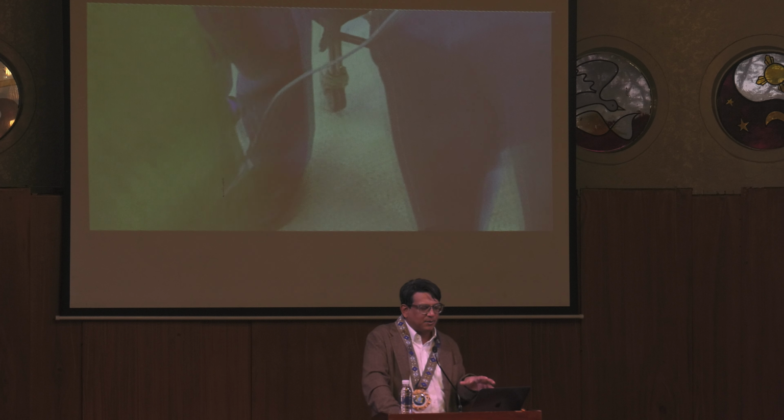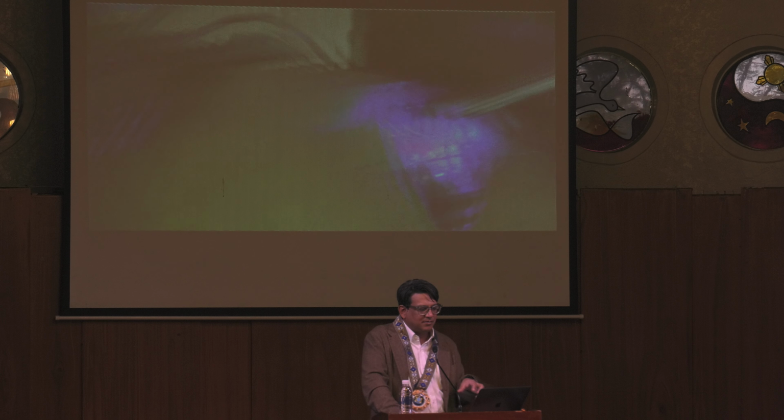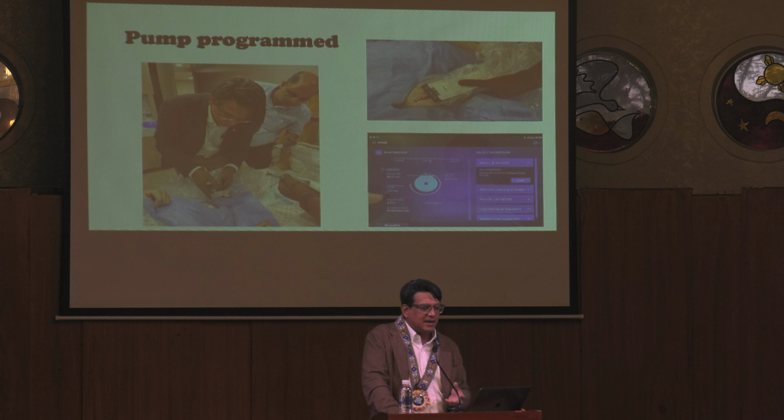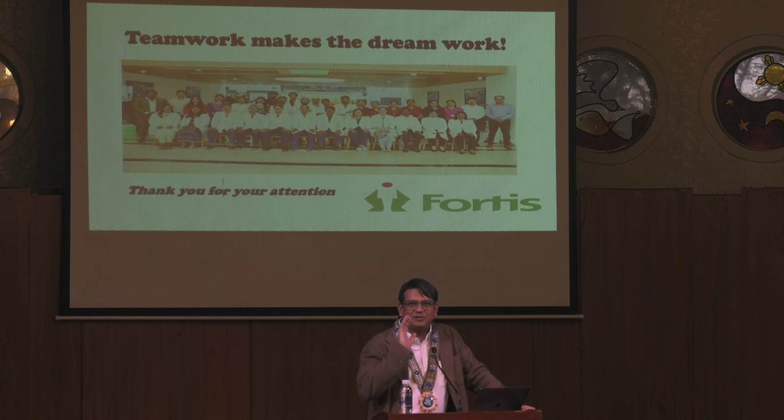So we program this pump through a Bluetooth device, so we can set the rate of flow, and then we can check. And the patient comes to daycare every 2 weeks, and we reinsert the chemotherapy, and that goes on. So this is not the normal chemotherapy. Don't think that this is how chemotherapy is given. These are special, very modern ways that we are helping patients improve outcomes through techniques like this. I hope you are not feeling nauseous.